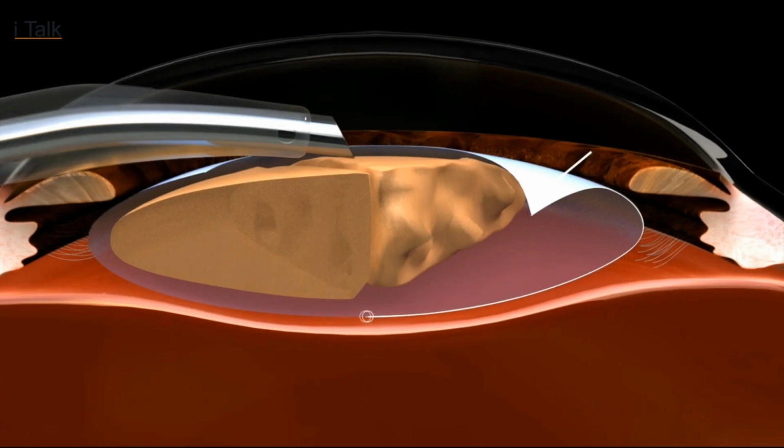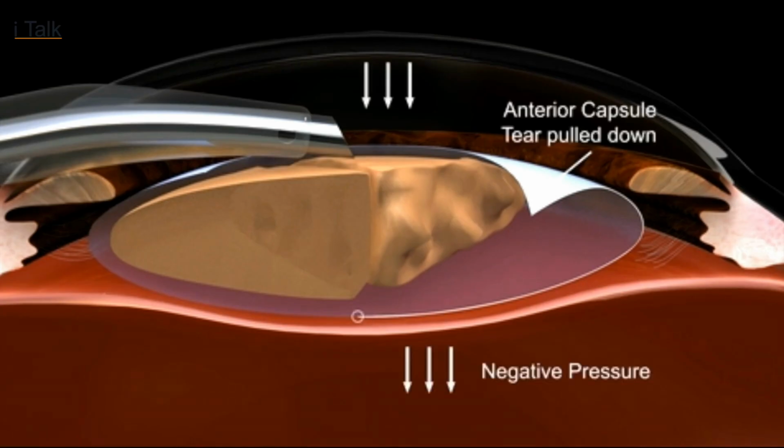So, Dr. Rohit, after how many surgeries did you locate this thing, or was it during the surgery, or you saw your videos and found this?